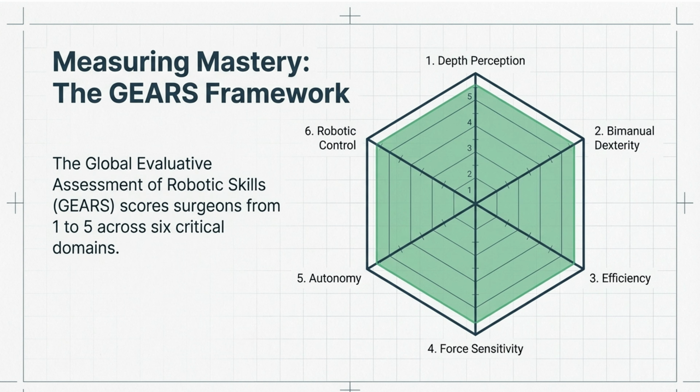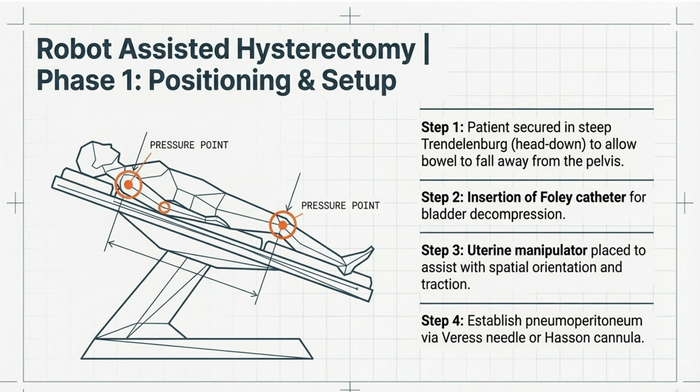This is just a little background so you guys can see what a surgeon goes through before actually being able to use the Da Vinci robot. It's not something they're just allowed to use whenever.